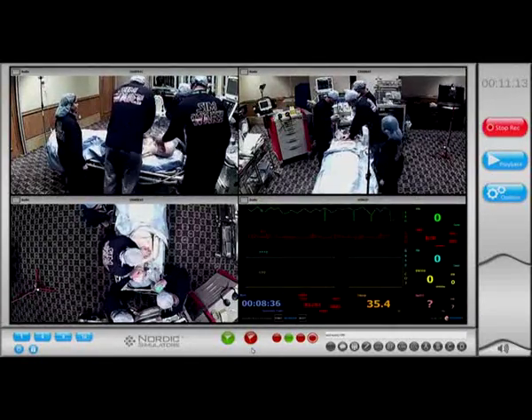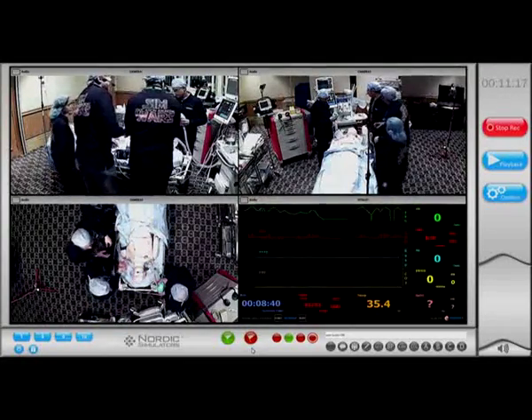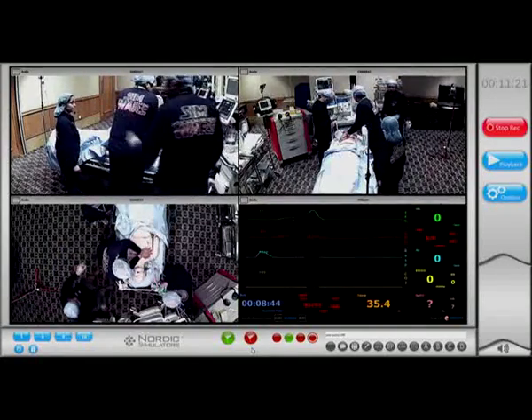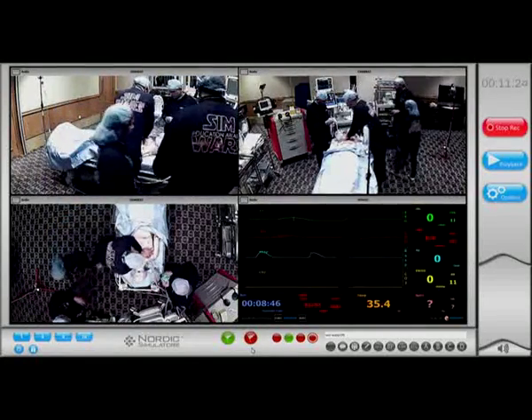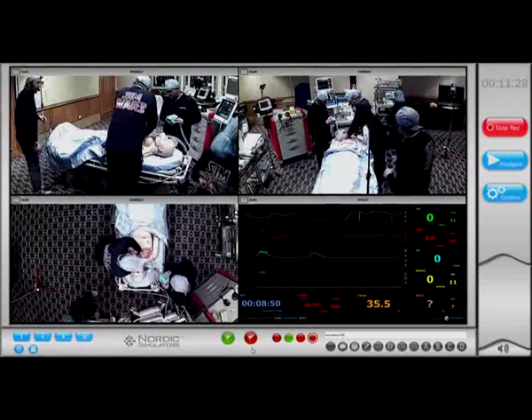Okay. Swap, Ahmed, with me, please. Let's analyze the rhythm. Asystole. Continue, Ahmed, CPR for 2 minutes. Give adrenaline every 3 to 5 minutes. 2 minutes finished, Dr. Yasser. Okay. Hard and fast. Fast, 100, please.